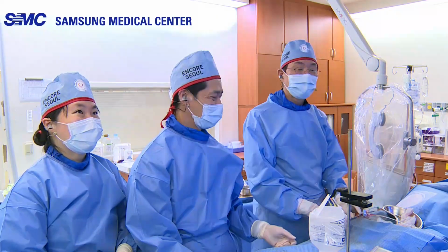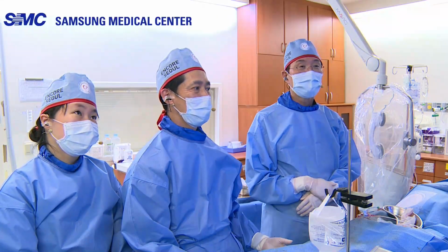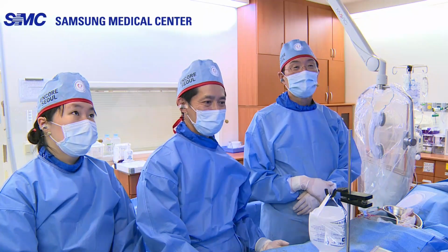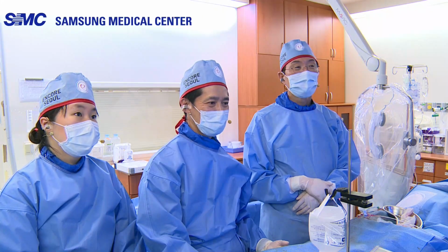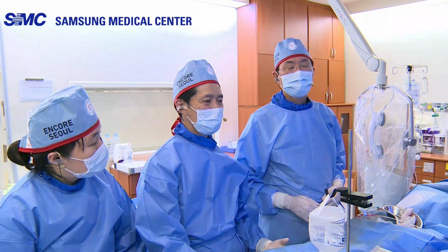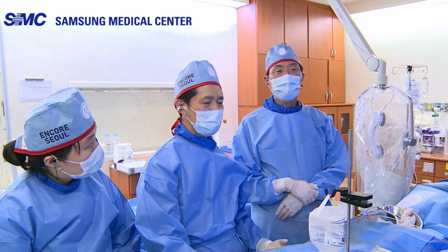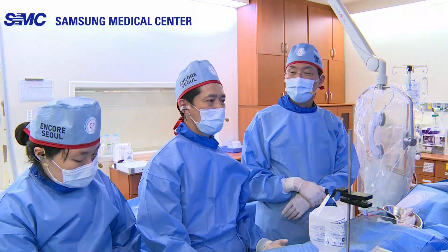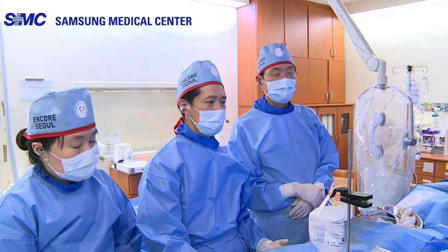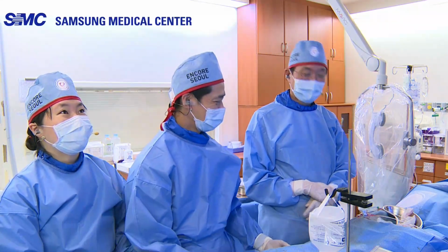I have one question for you regarding the RCA. You leave the RCA unrecanalized. Is it appropriate to judge the viability after just 3 weeks? Yes, because this patient had symptoms 3 weeks ago, a small MI, and echo and EKG still show strong evidence of aneurysmal dilatation. She has renal dysfunction, so we cannot use dye. Okay.